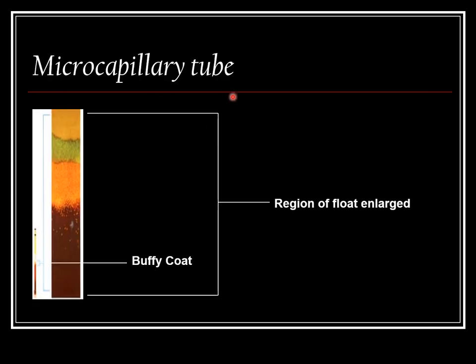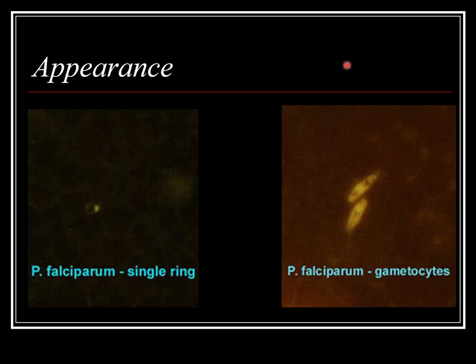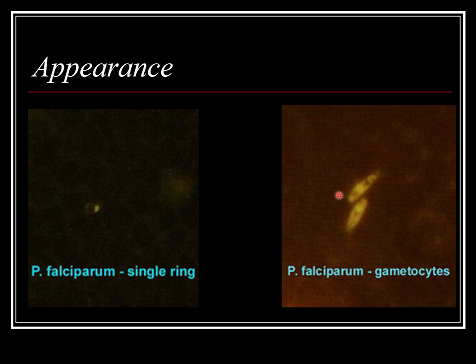Here we can see the microcapillary tube with the region of the float enlarged. After centrifugation, beneath the buffy coat layer, the parasitized RBC layer is visible. Under fluorescent microscope, when we focus on the area containing parasitized RBCs, we can see the Plasmodium parasite. The ring form appears in apple green color, and these are gametocytes of Plasmodium falciparum — a single ring form and gametocytes are visible.